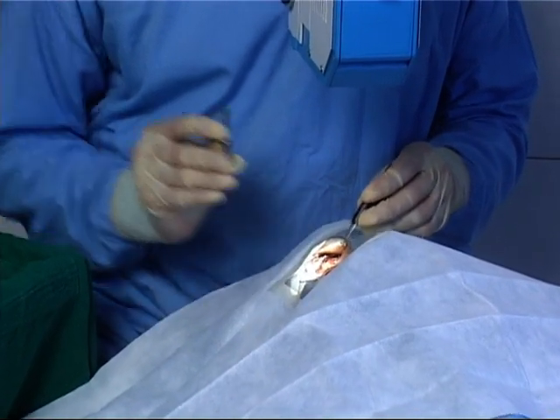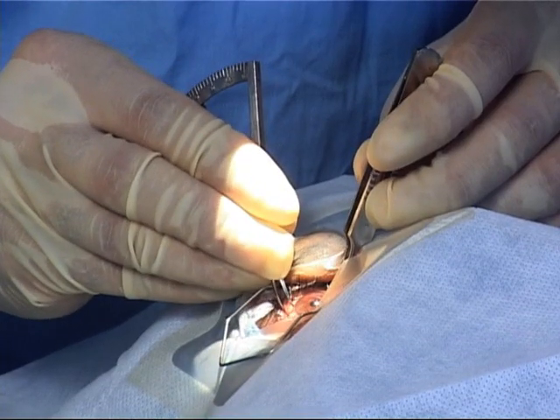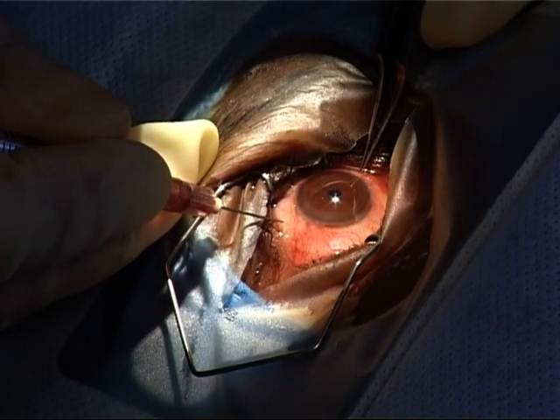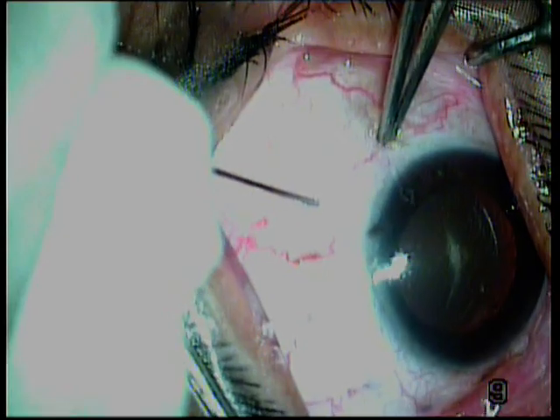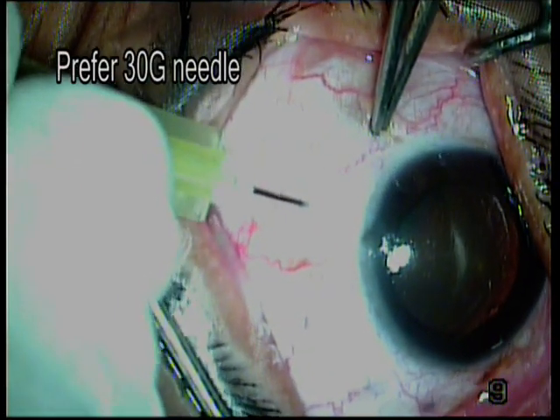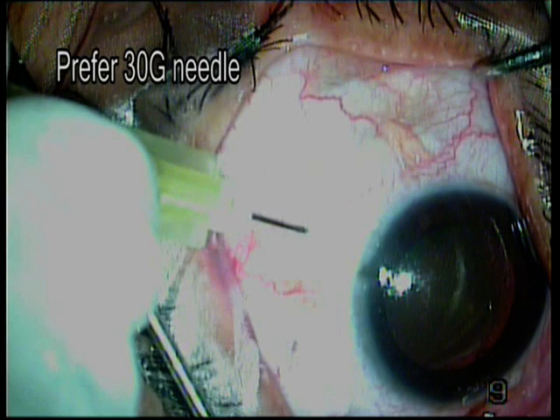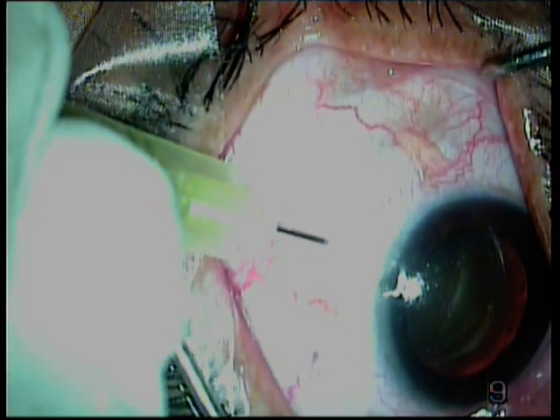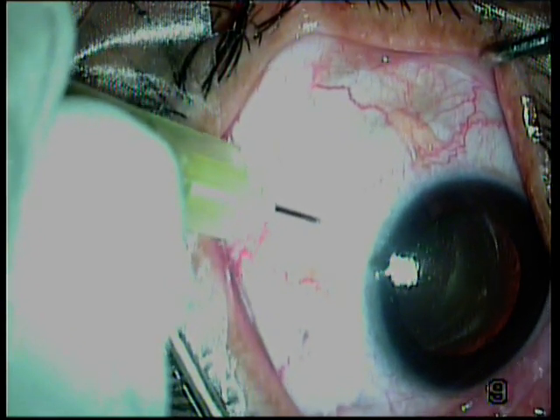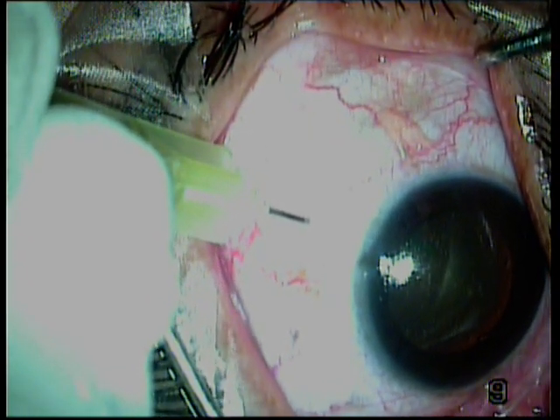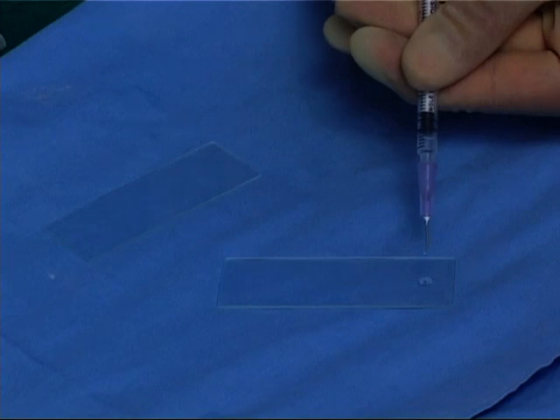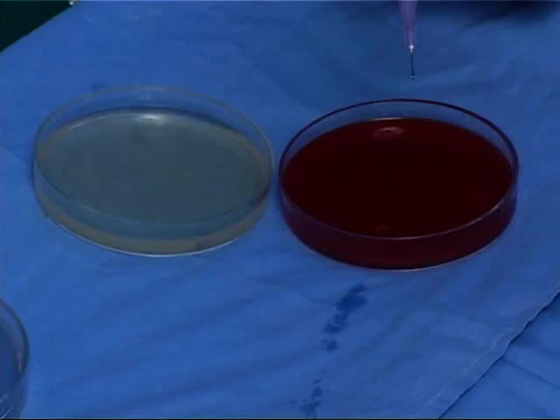Mark 3.5 mm posterior to the limbus in the pseudophakic eye using calipers. Fix the globe with fixation forceps and insert a 26, 27, or 30 gauge needle with the bevel facing upwards and directed toward the mid-vitreous, with the tip of the needle being directly visualized. Take a vitreous tap before injecting the drug, placing it on two different slides and the rest onto the agar plate for incubation.